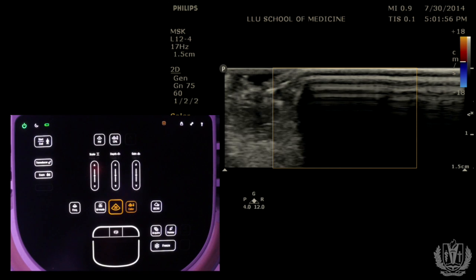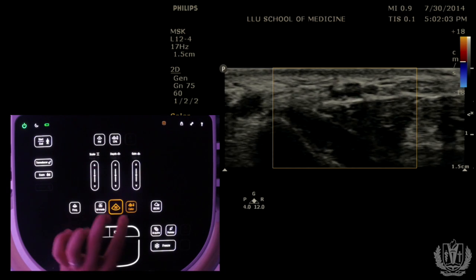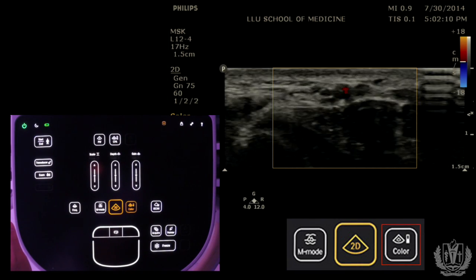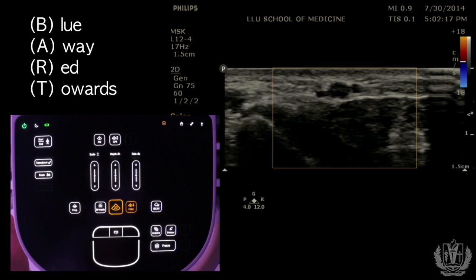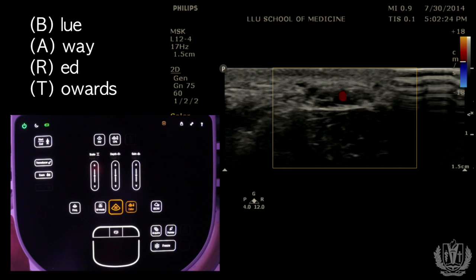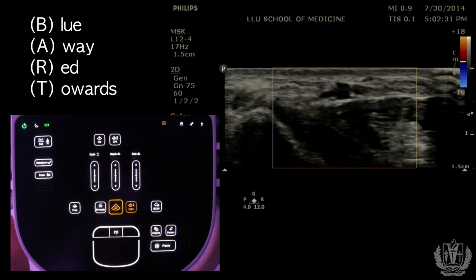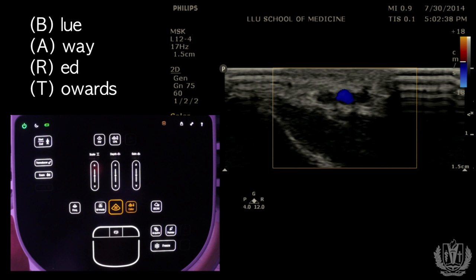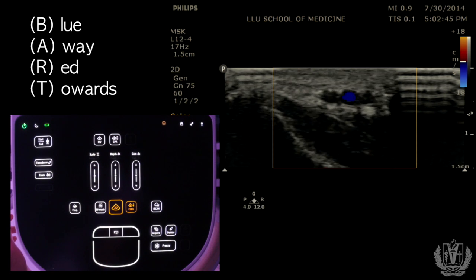An important feature is color flow Doppler. You push the color flow button and it turns on color flow Doppler. Red means blood flow is towards the probe, and blue means away from the probe. There's a helpful mnemonic called BART — Blue Away, Red Towards. If I tilt the probe so blood is going towards it, the flow shows as red. If I shift the angle so blood flows away, it turns blue. Remember: red does not mean artery and blue does not mean vein — it only indicates the direction of blood flow relative to the probe.